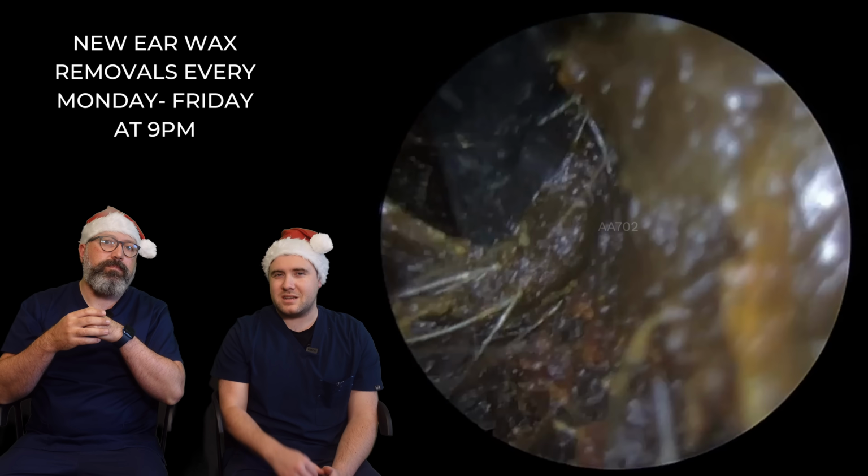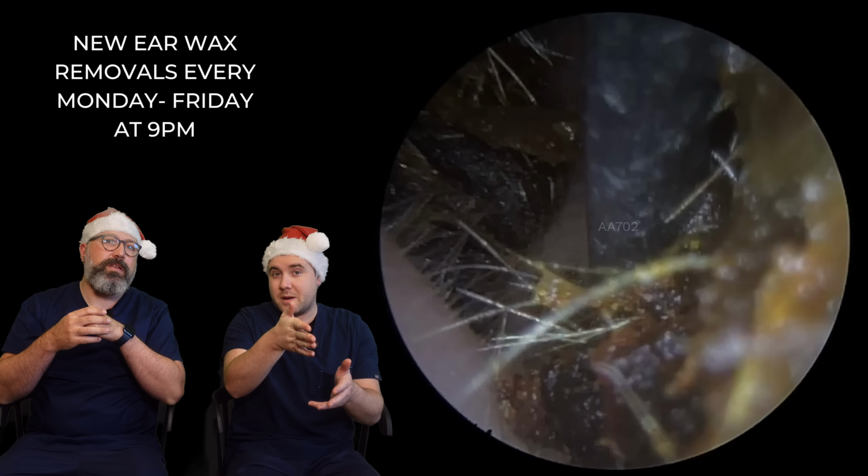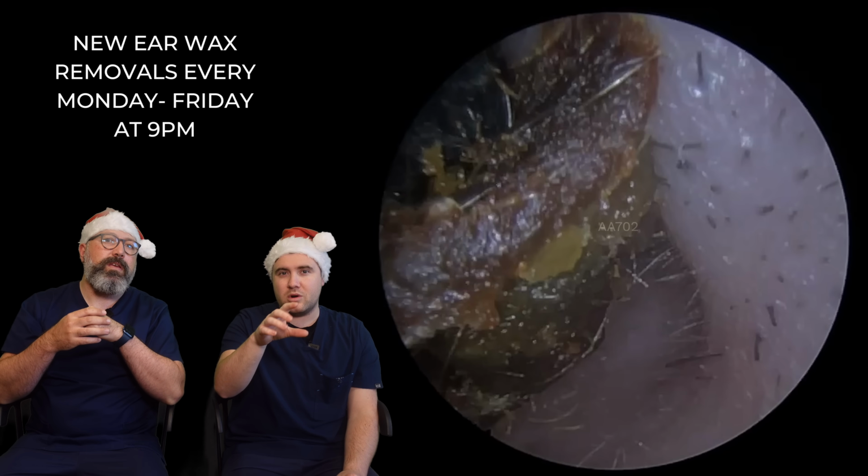Yeah, I was going to say that. I can see that's what you just mentioned there, almost wedging it up against that side of the ear canal. You can see it's just broken off quite a large piece there.